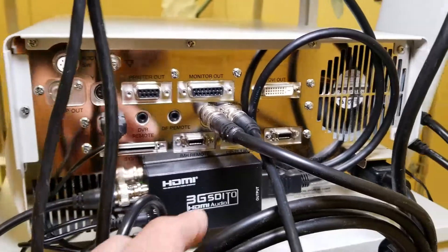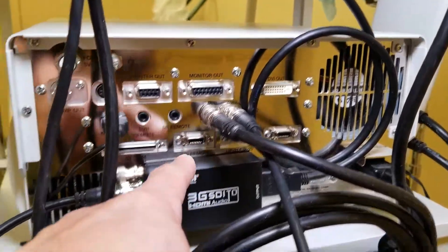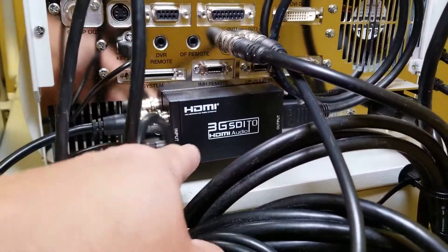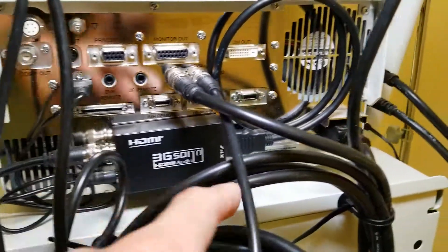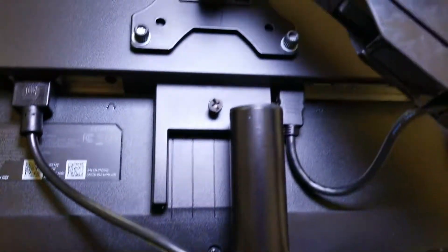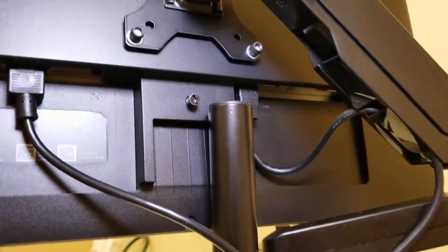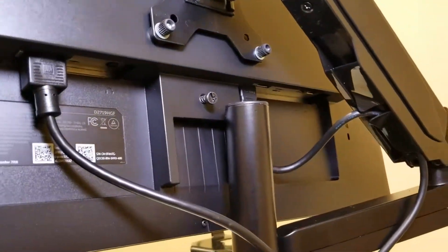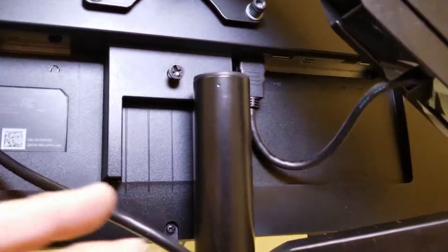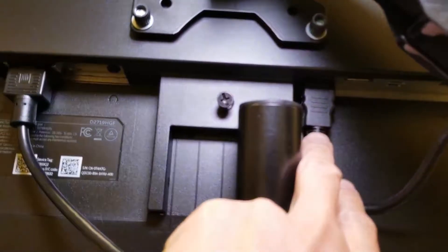The signal goes from the processor to the converter out to HDMI and up to this monitor. It is a lot easier to find video monitors that have HDMI inputs, and this one goes right there.